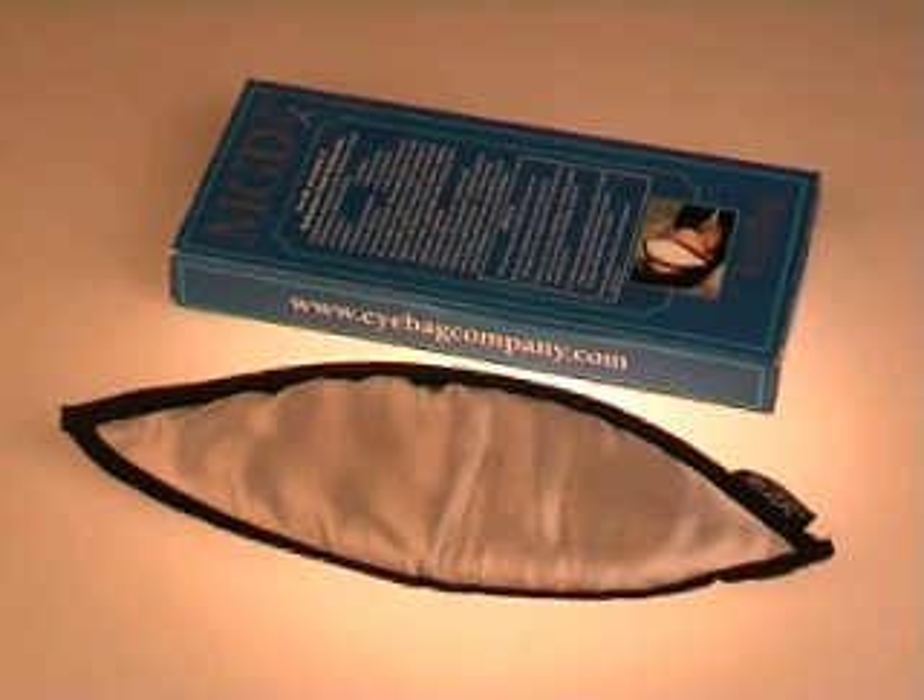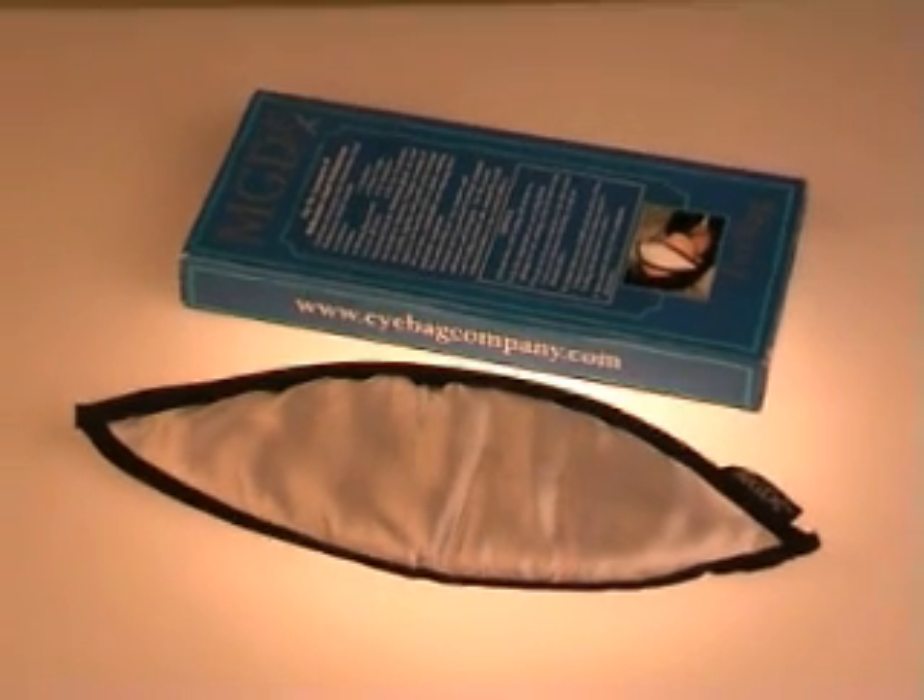Meibomian gland dysfunction, MGD, is a common feature of these problems. Twice-daily hot compresses are the standard treatment for MGD. It became obvious to me that many patients just didn't do the hot, wet flannel treatment.